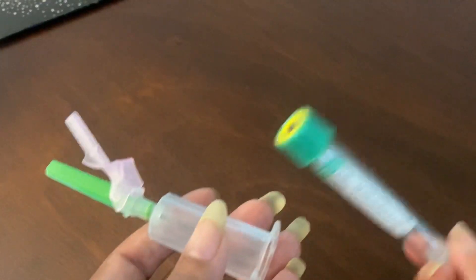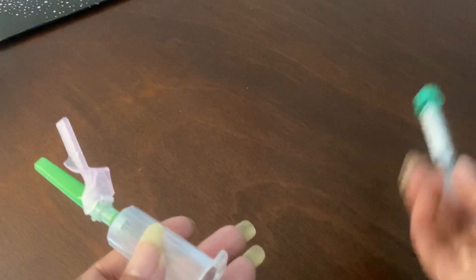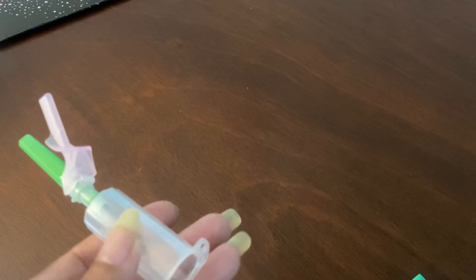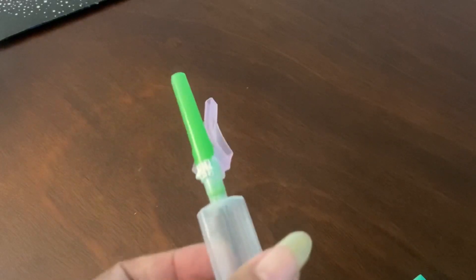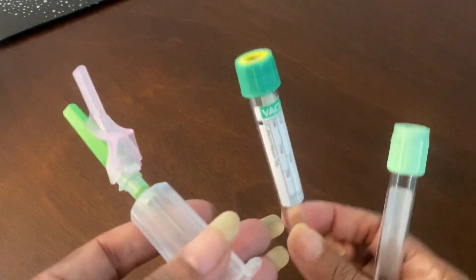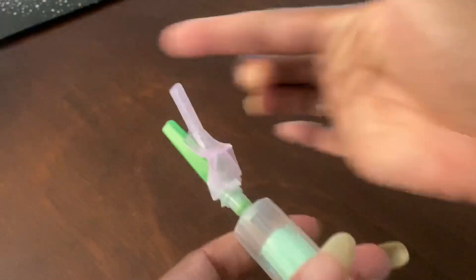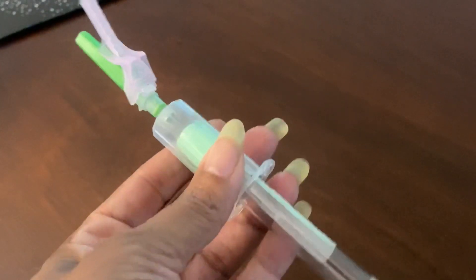If you do accidentally puncture a tube, don't continue trying to move the needle around to get blood into it — it's no good. Trash that tube and get another one. You have to start over. If your needle is still in the vein, you don't have to come out. You just need a new tube. Trash the old one, get a new tube, puncture it while still in the vein, and your blood should flow.